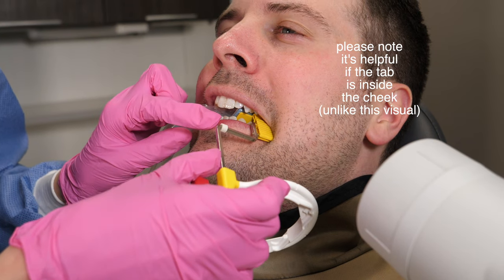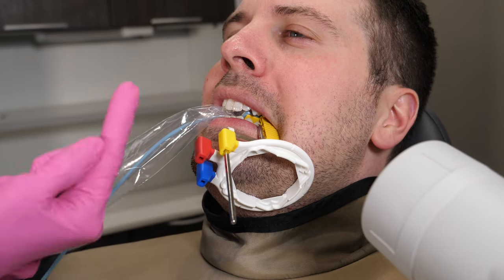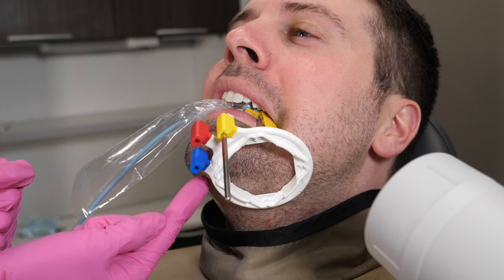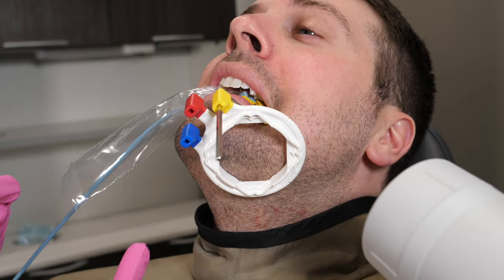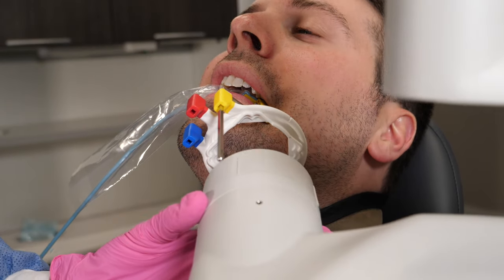In addition to angling the tube, it's sometimes super helpful to ask the patient to put their chin up or their chin down, or to look forward to help you take a good picture. Chin up usually helps a lot when you need a PA of the lower posteriors, and chin down or looking forward helps when taking bite wings. You can also adjust the headrest if they need extra assistance with this.